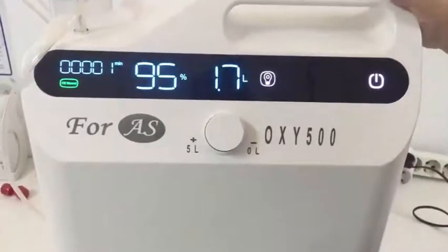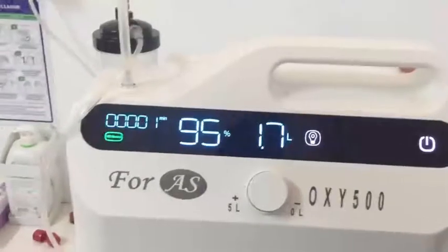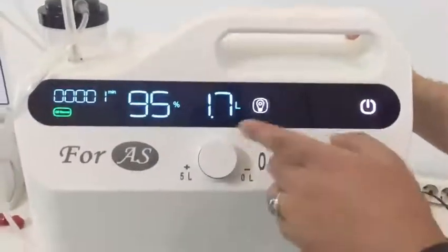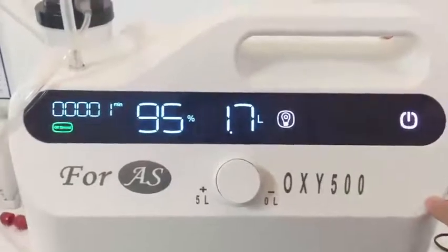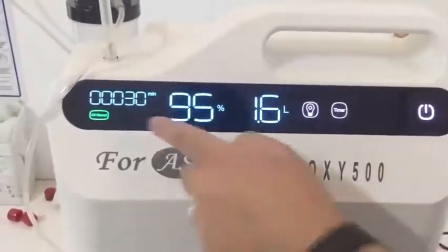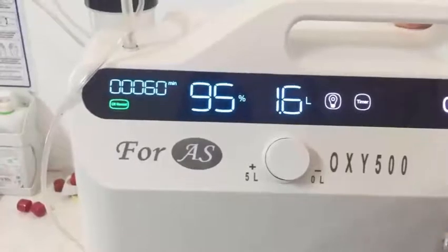There is a timer here — for example, if you set the time, after one hour the device will stop operating. If you want the device to operate without stopping, you must adjust the timer to zero; this programs the device to operate continuously. In this section, you can also turn the screen light on and off for the comfort of the patient at night.